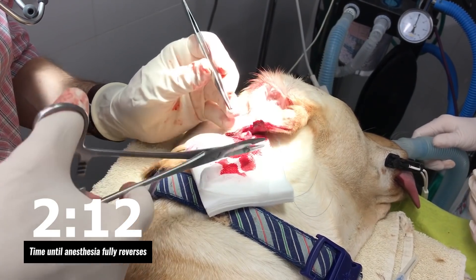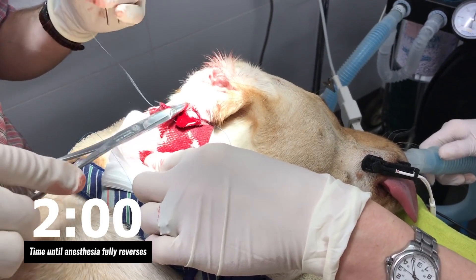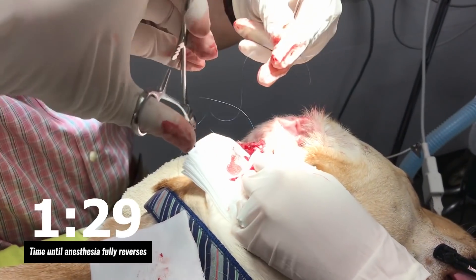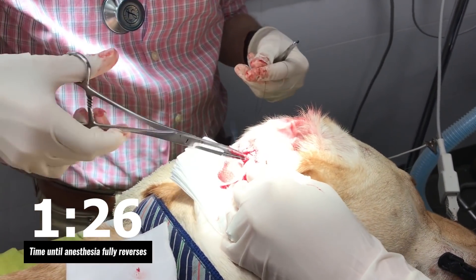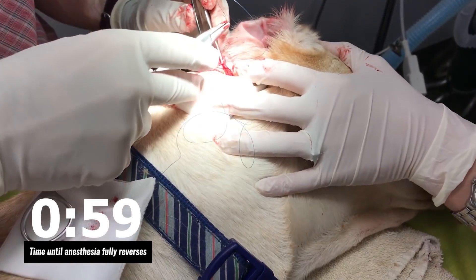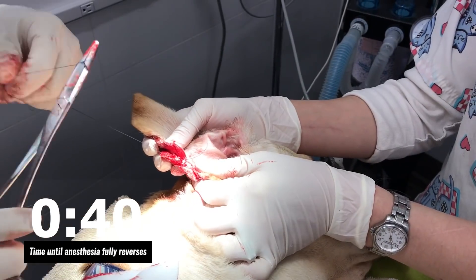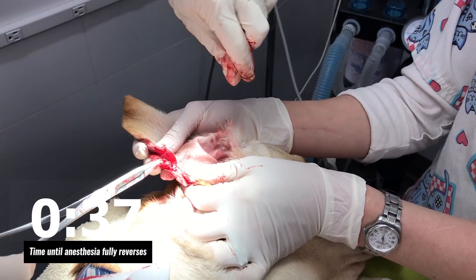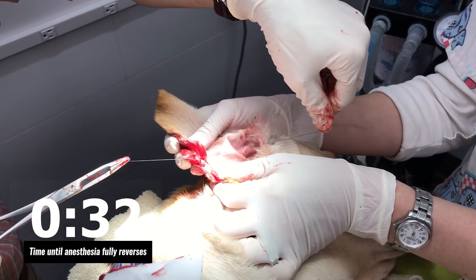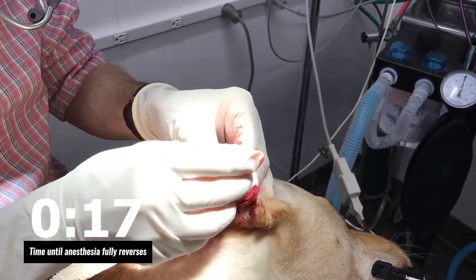Well, be quick about your two stitches then. It comes together. One more stitch in here to pull this together. Is he jumping? No, he's starting to. Okay, let me just hold this. Good thing we have lidocaine, huh? It's tight. Let's put some glue right on this side just to keep it from being too messy.